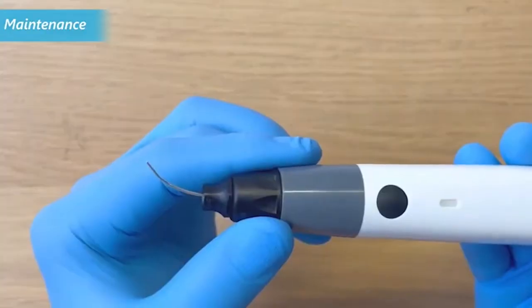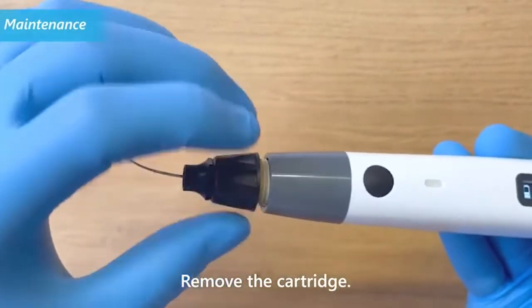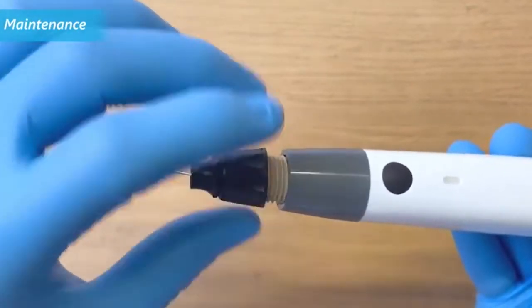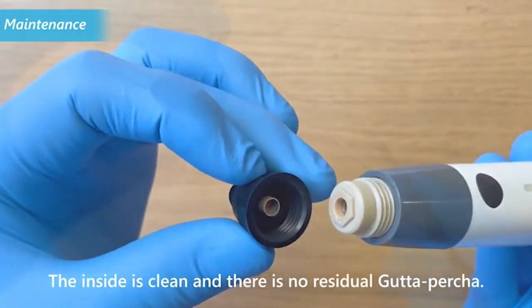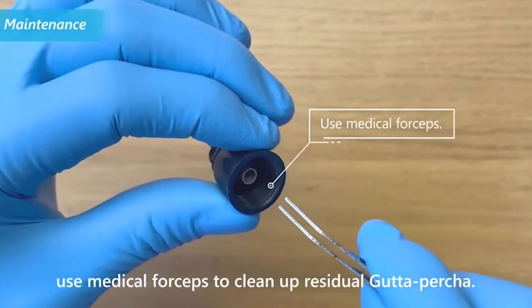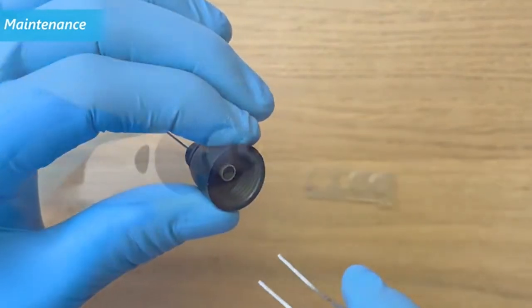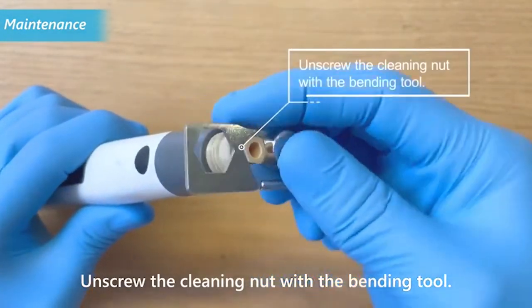Remove the cartridge. Check that the inside is clean and there is no residual gutta percha. If there is residual gutta percha inside, use medical forceps to clean it up. Unscrew the cleaning nut with the bending tool.